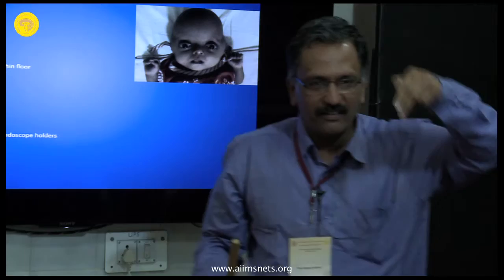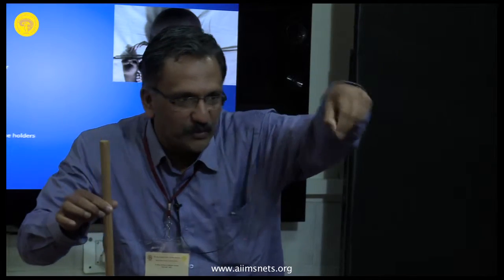Just a small thing. I'll repeat it again. See the whole thing going inside. Take it a little, so that guides you to where you want to go. Touch the tumor. Go a little deeper and twist it a little. And then close it, so you have adequate tissue, and then you take it out. A small thing, but it really helps.